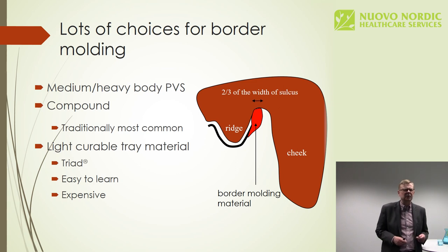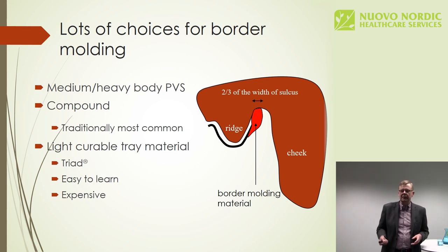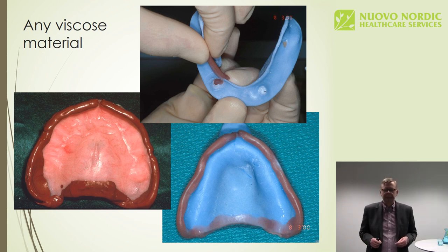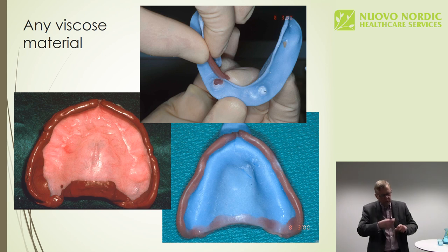It's a bit hard to use because you tend to burn the mouth of the patient easily. Also, light curable tray materials are useful. You just apply the material, as you can see in this picture, on the border of the tray, perhaps warm it up in hot water, it will soften, and then you have all the time in the world to mold the borders in the mouth.